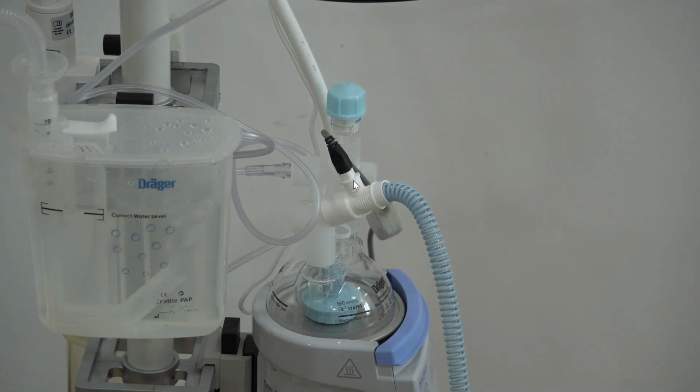Also to mention, Marguerite, is that the high-end machines are no longer CPAP. And also to remember that this system frees up a machine for a baby that will benefit and require it.